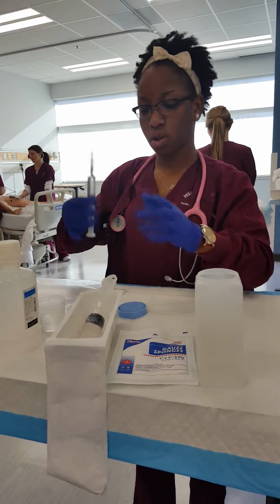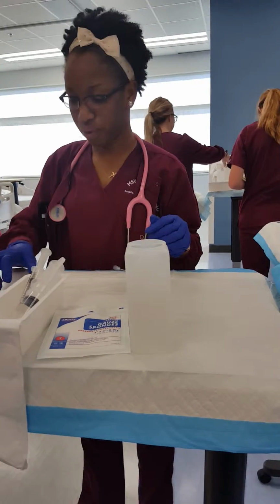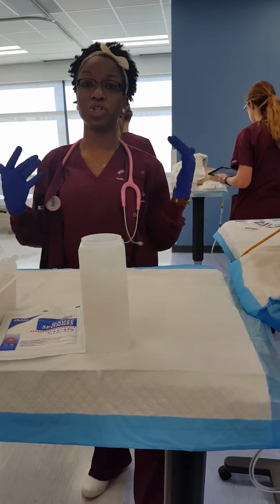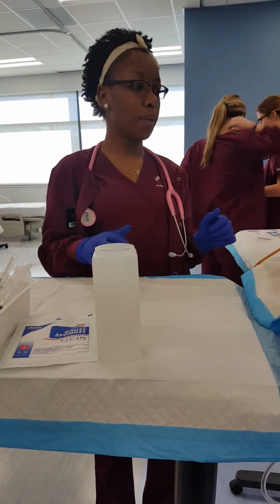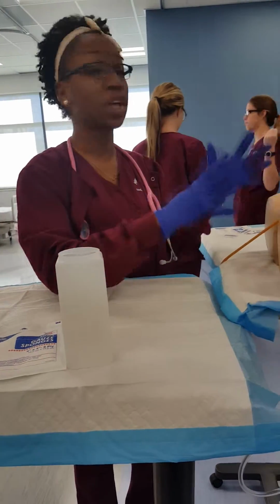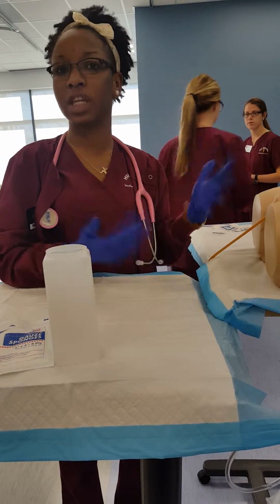So I have my irrigation and my medication ready. I'm going to tell the patient to relax, take a breath and breathe out slowly. I'm going to position him and do a little perineal care to clean this area and check for skin integrity.